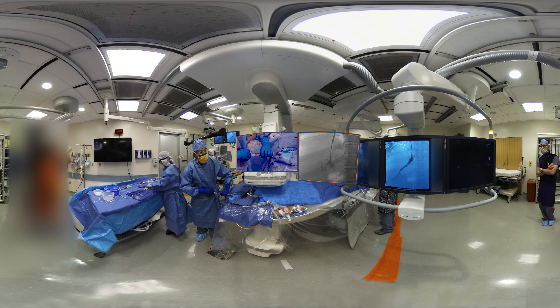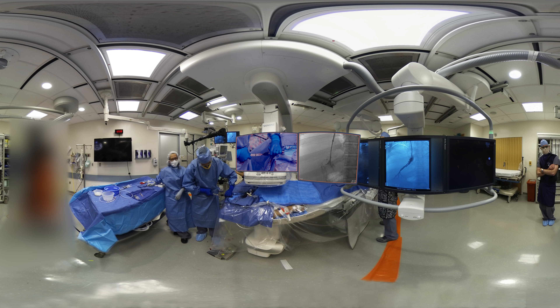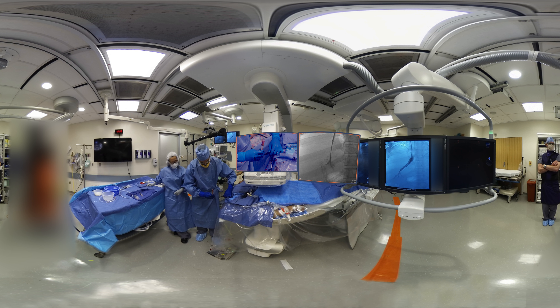And then again, I'm just going to make sure that the needle is clear, which it is. A little bit of spill back in the hepatic vein. And then again, the same procedure — angle control with the back hand pushing forward. The trailing fingers are holding the outer sheath in place; the Colapinto sheath is being pushed. Let the needle rotate just a little bit there to get a better seal and see if we can find a suitable branch.